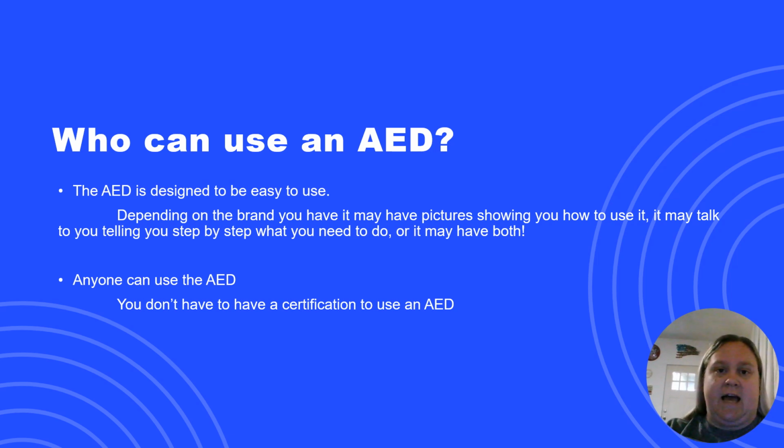So with that being said, the fact that they're designed to be easy to use, and they have pictures, and they talk to you, that's why anyone can use an AED. You don't have to have a certification. It's nice, but you don't have to have it.